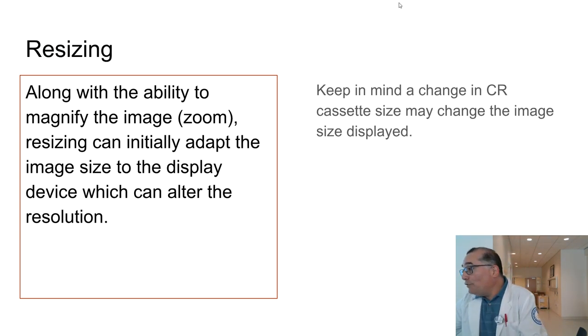Resizing, we sometimes do this, mostly not for us, more for radiologists to see within an area. Just recognize that when you zoom in, you are going to lose some spatial resolution. The image gets a little bit blurrier, but bigger. And again, it may allow a radiologist to see something that they might not have seen. And then, of course, from there, they can go back and reduce the size, keeping that region of interest in mind, which might help them pinpoint something that they couldn't have seen, perhaps.